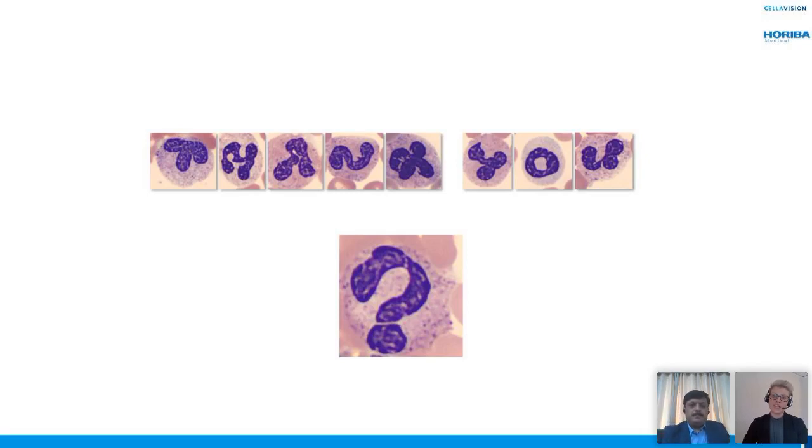But I think the issues are when it also goes into high temperatures, and the heat is many times more of an issue when you need to transport the sample or the tube itself. Okay, by this I get that it should be stored like the normal sample. Yeah, exactly. It should be stored as the normal hematology sample. The smear that is made should be made from the hematology blood tube, the EDTA tube.